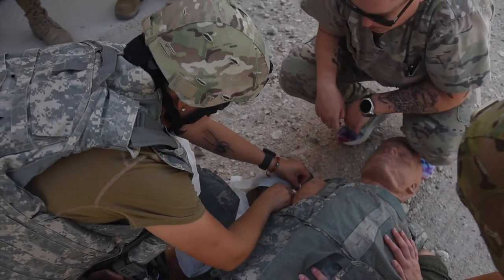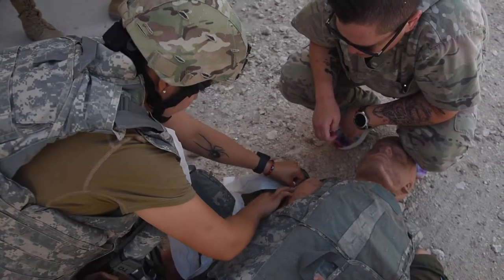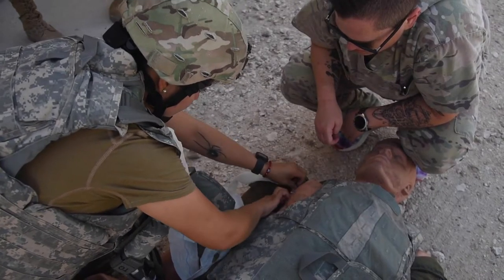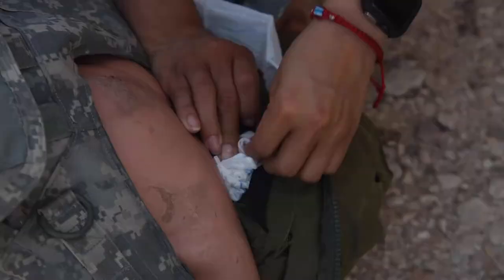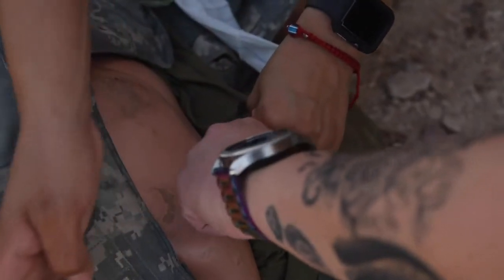You need to do a couple more wraps right here to keep that pressure on. Keep that nice pressure — one for one. What are you doing while she's packing this wound?